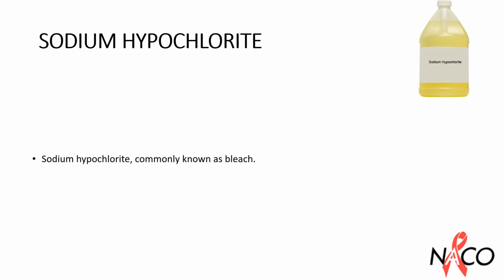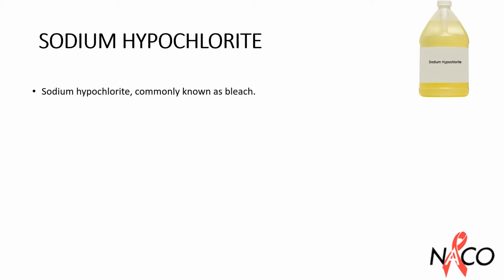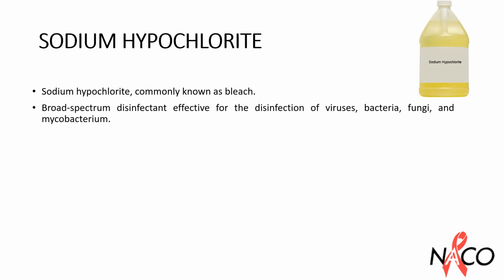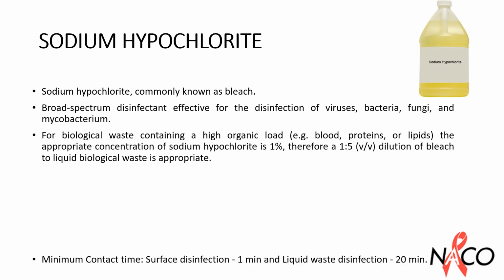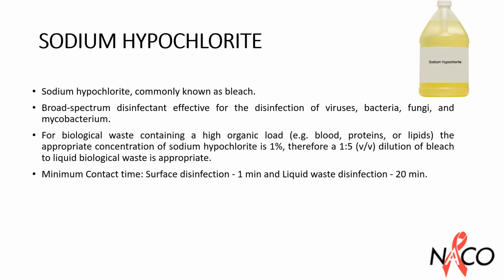Sodium hypochlorite, also commonly known as bleach. It is a broad spectrum disinfectant effective for the disinfection of viruses, bacteria, fungi, and mycobacterium. For biological waste containing a high organic load, for example, blood, proteins, or lipids, the appropriate concentration of sodium hypochlorite is 1%. Therefore, a 1 to 5 volume by volume dilution of bleach to liquid biological waste is appropriate. Minimum contact time required for surface disinfection is 1 minute and for liquid waste disinfection is 20 minutes.